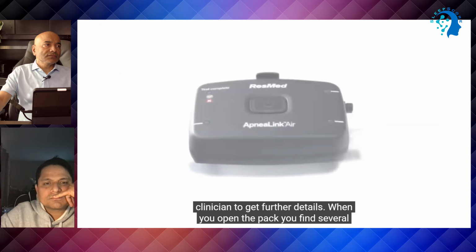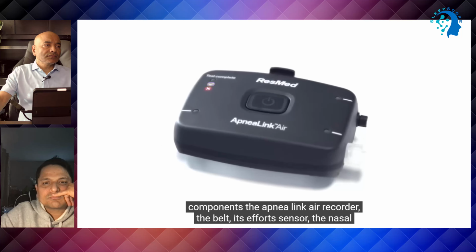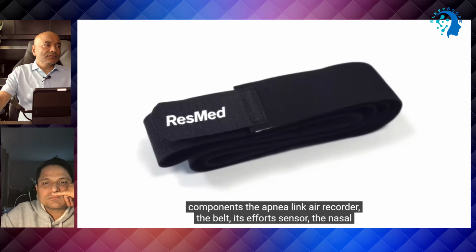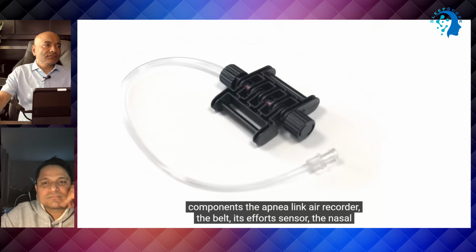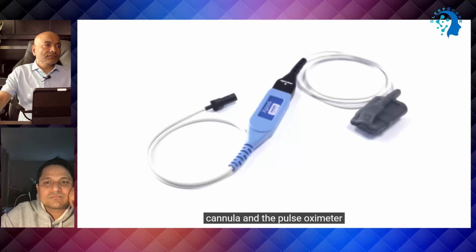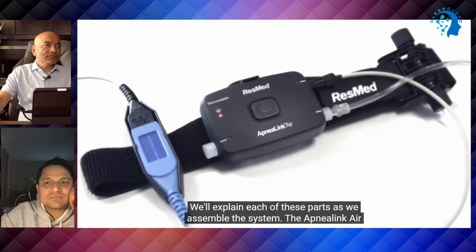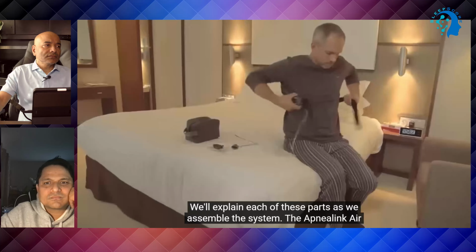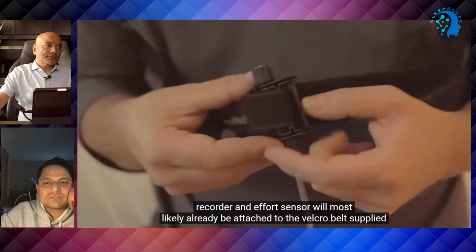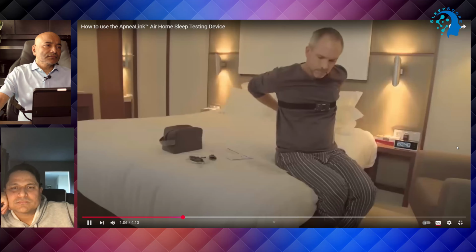At any time in the setup, you can also refer to the patient instructions provided by your clinician to get further details. When you open the pack, you find several components: the Apnea Link Air Recorder, the belt with its effort sensor, the nasal cannula, and the pulse oximeter. We'll explain each of these parts as we assemble the system. The Apnea Link Air Recorder and effort sensor will most likely already be attached to the Velcro belt supplied.